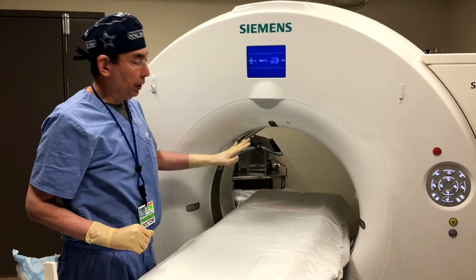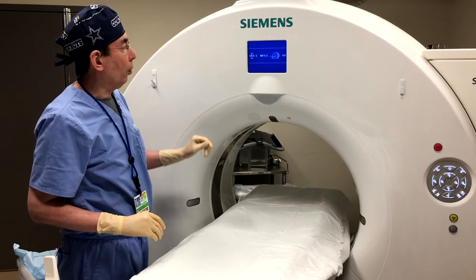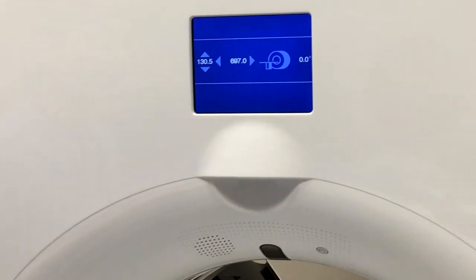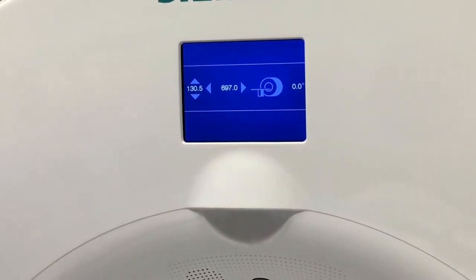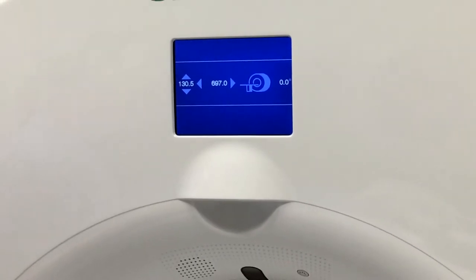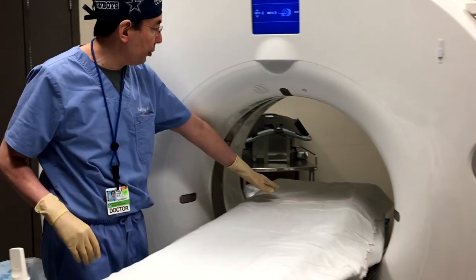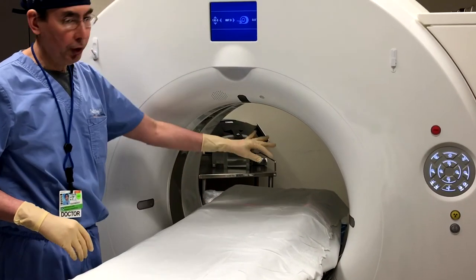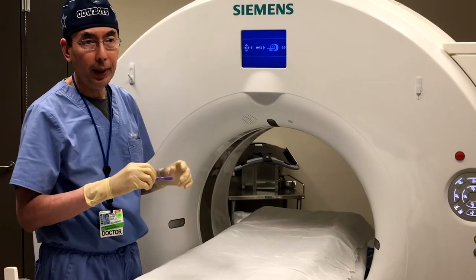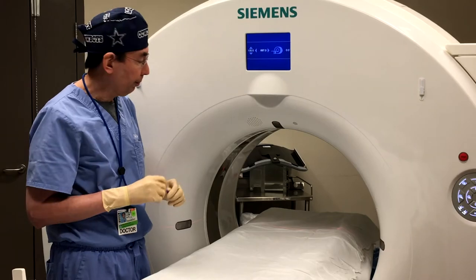We talked earlier about placing the grid on the patient. After your preliminary scan you're ready to mark the scan. When you're at the console and have picked the image slice you want, walk into the room and confirm it's the correct table position. Pressing the top button turns on the laser light — you can see it projected on the sheets and on the patient's body. That's the line where you'll put your mark with your radiopaque marker, and because you have the grid on, it shows exactly where the grid line is.